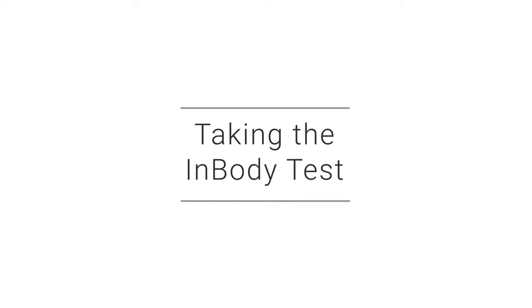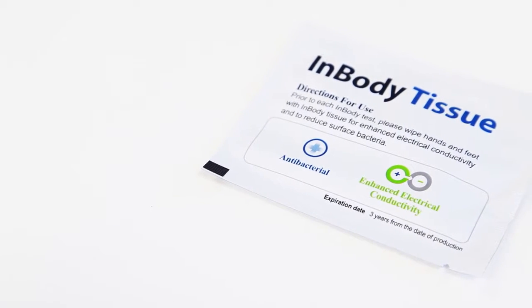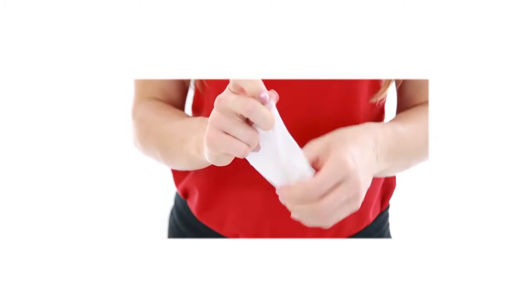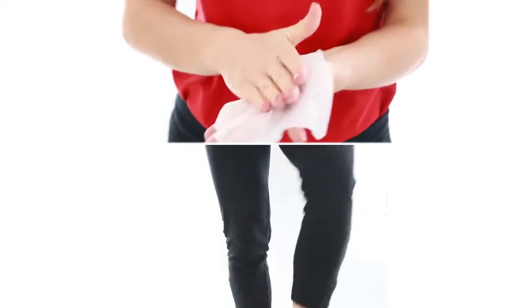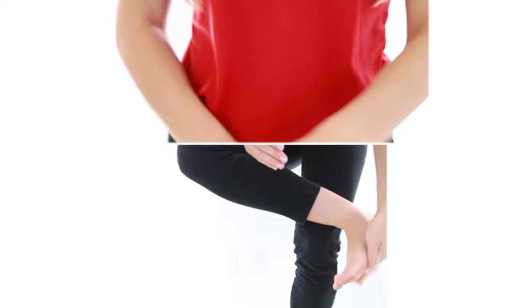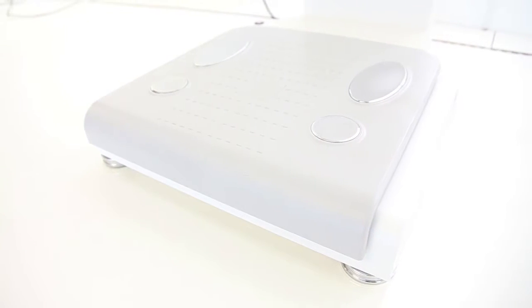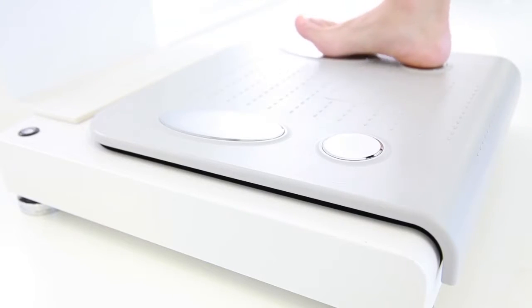Taking the InBody test. Wipe your hands and feet with an InBody tissue. The InBody tissue will help enhance your body's conductivity. Step on the InBody to measure your weight. Make sure to align your feet with the foot electrodes.